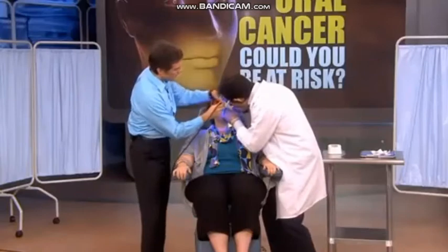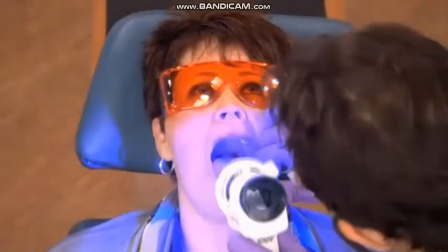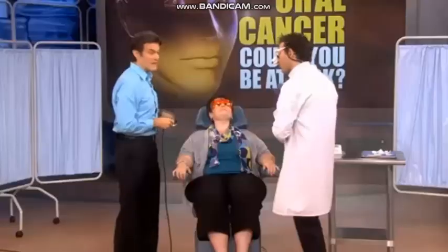It's a narrow blue light. I'm just going to put this on there so everyone can see as well. A narrow blue light with special filters. And you see the green, the kind of apple green color. That means health. But when the cells start changing a little bit, let me show you an example of what happens when they do change.